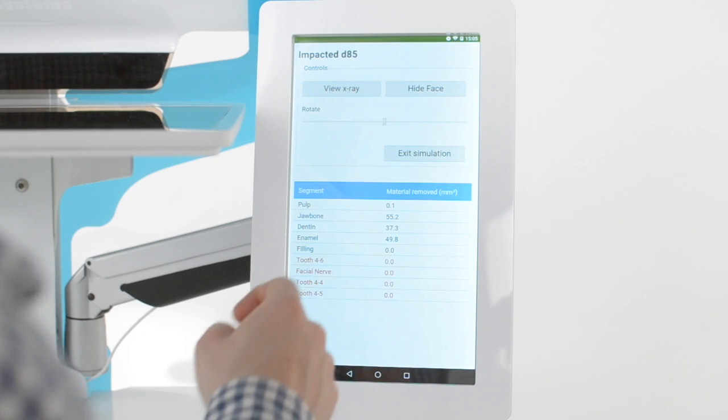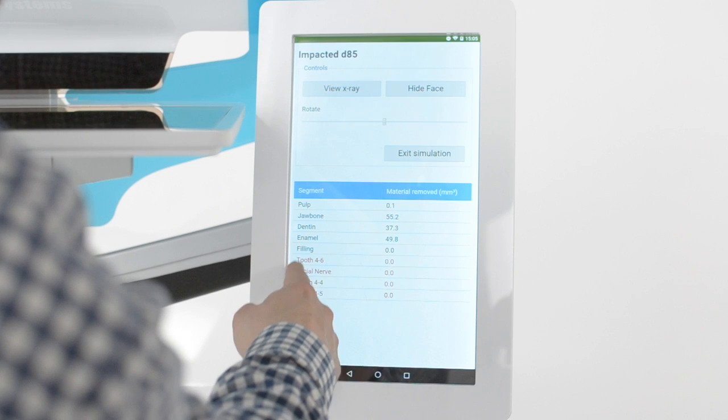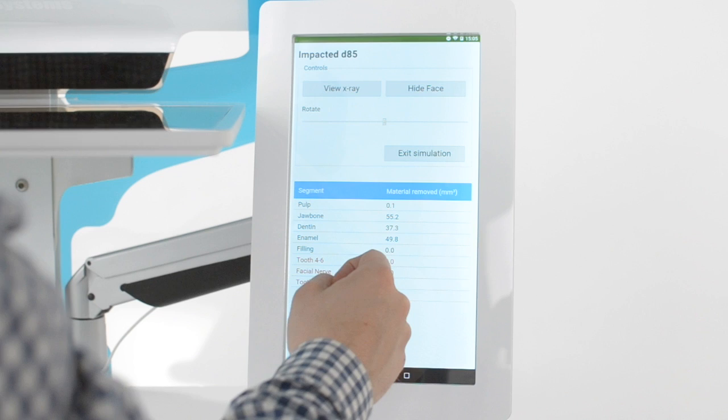When I'm done — or actually also during the procedure — I can read how much material I have removed and if I have hurt any critical tissue. I can also save my work and replay it later.